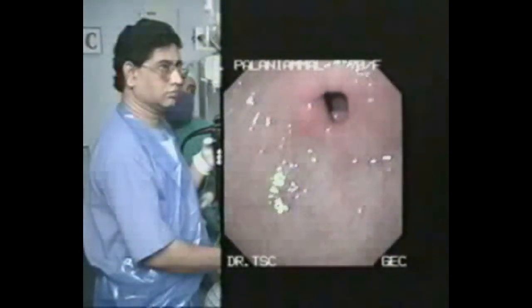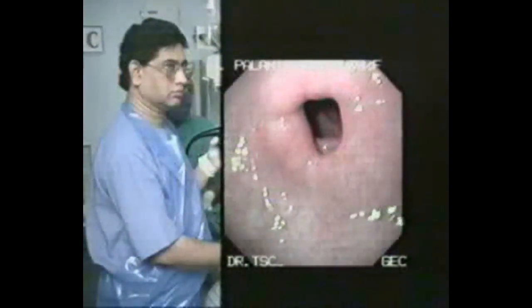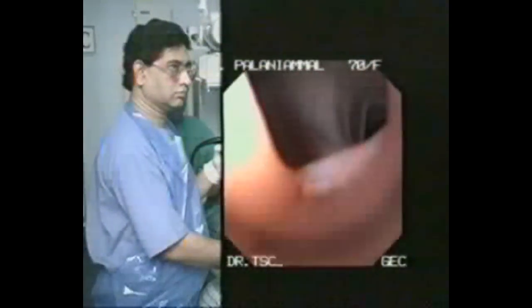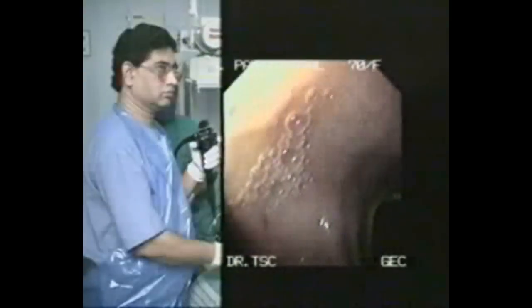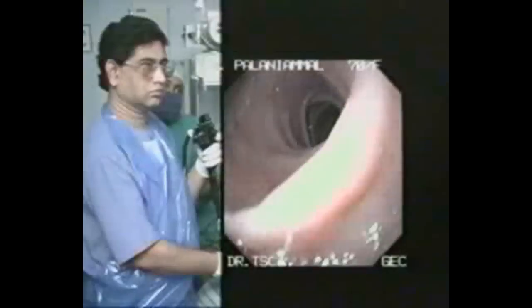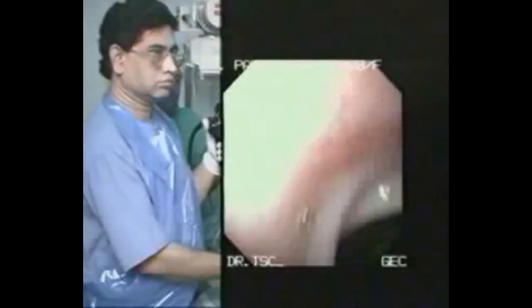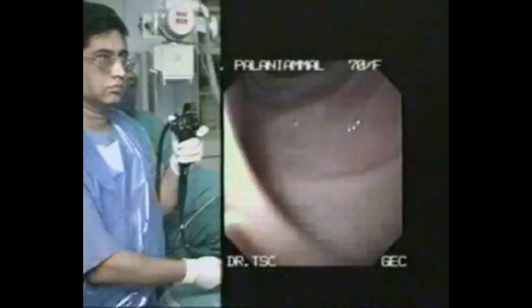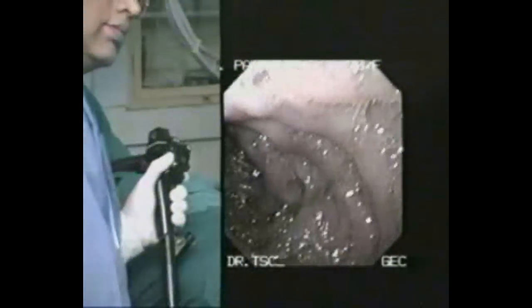Negotiating across the pylorus, one needs to develop eye and hand coordination. You are now watching the first part of the duodenum, which is featureless. Entry into the second part of the duodenum is possible by turning the body to the right along with the axis of the endoscope, with the bigger wheel up and the smaller wheel to the right.